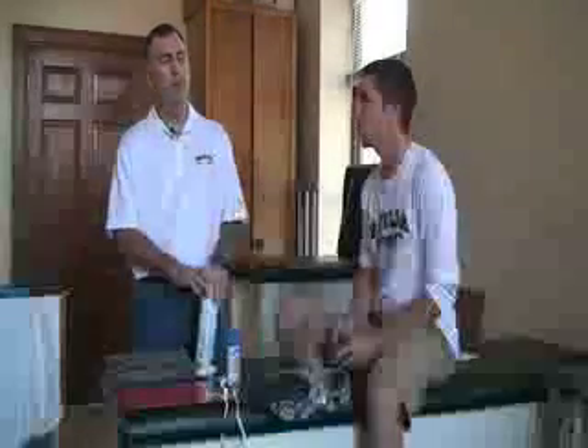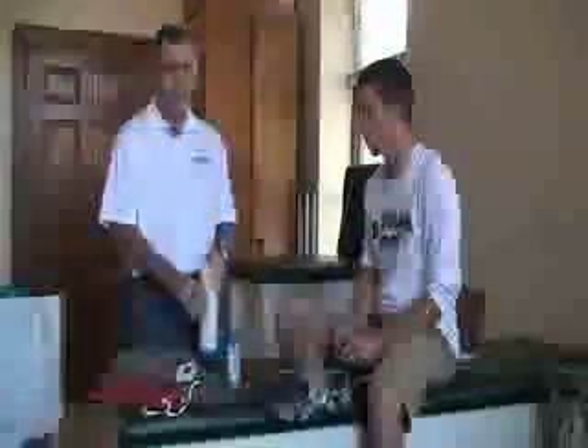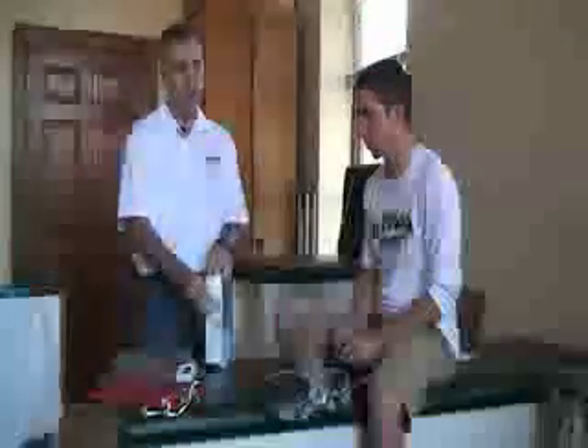First thing that we're going to do for the cryo spray, cold spray, is we want to make sure that we have all of our equipment: our towel, our timer, our patient chart, as well as we have two different cold sprays that we can use. We're going to be using the larger one by Kramer for this demonstration.